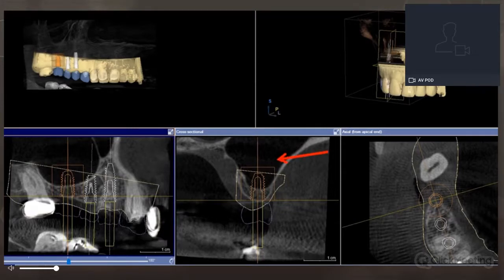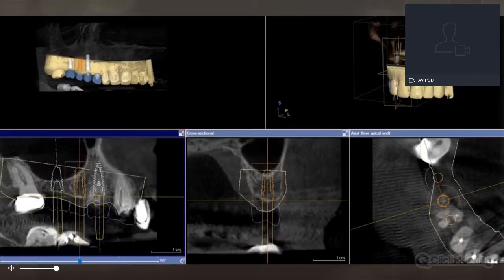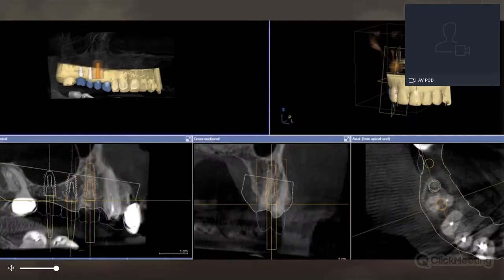So we can see that definitely we're going to need a sinus. On the second implant again, partially require sinus graft. When we get to the third one, we can actually see, instead of trying to follow the bone which sits between the two roots, we have to follow the palatal root in here to try and avoid the buccal perforation, which would happen if we had to follow the buccal root as a guide for placing the implant in an analog method. But the important thing is, you'll see on the blue outlines that the prosthetic envelope is really well respected for where these implants should be.